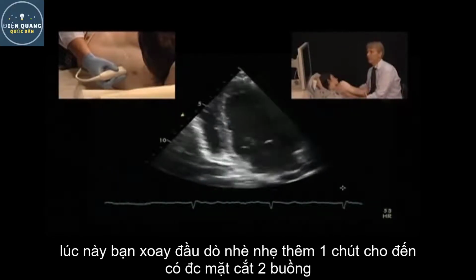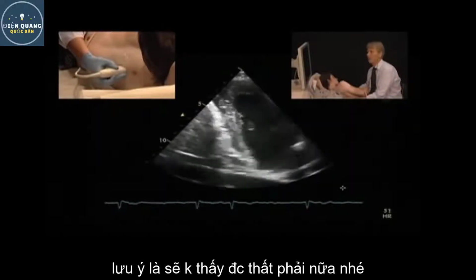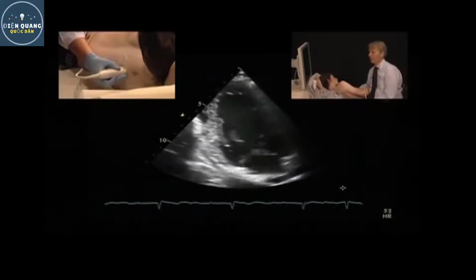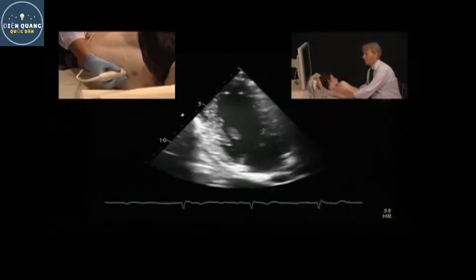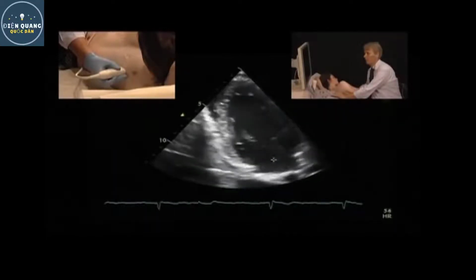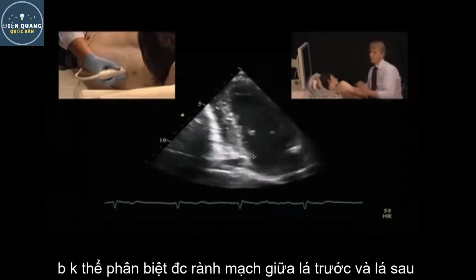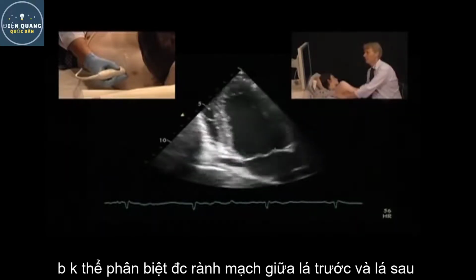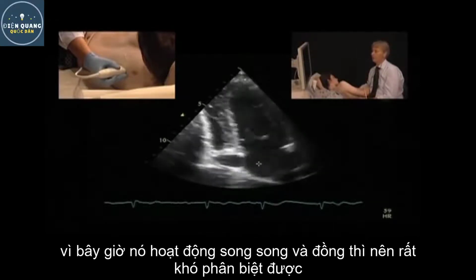So you rotate more and more until you finally arrive at the two-chamber view where you do not see right ventricular structures. In the two-chamber view, what you will be seeing here is the anterior wall, the inferior wall, the left atrium, and the mitral valve, where you cannot distinguish between anterior and posterior leaflet, simply because you're now exactly parallel to the commissural closure line.